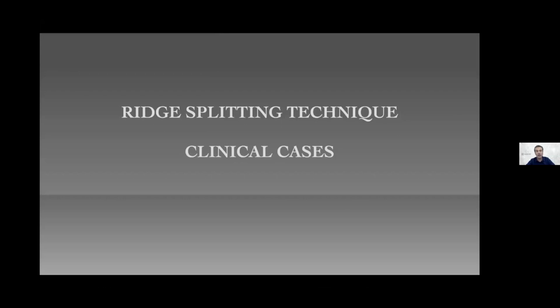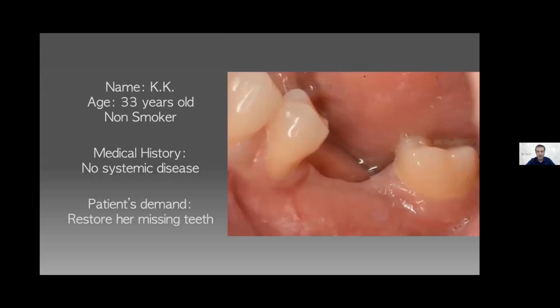I will start my presentation with the first case I selected in the mandible, and I selected a very hard case. Really, it was a very tough case. This was a female, 33 years old, with no systemic disease. The patient demanded restoration of her missing teeth.